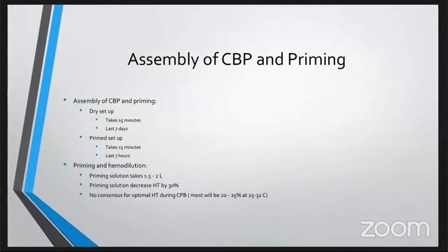Moving to assembly of cardiopulmonary bypass and priming. For assembly of cardiopulmonary bypass, we have the dry setup. It takes 15 minutes and it lasts for 7 days. For the wet setup or prime setup, it takes 15 minutes as well and it will last for 7 hours.